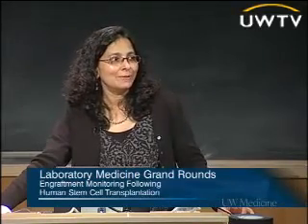That's a very good question, and actually it is. That's something one would want to investigate in a few so-called normals, and also multiparous women. You'd want to look at individuals that had received a solid organ transplant and had then had a nephrectomy, so there should technically not be anything left behind. These are samples one would want to test, because that kind of interference would definitely call any result into question.